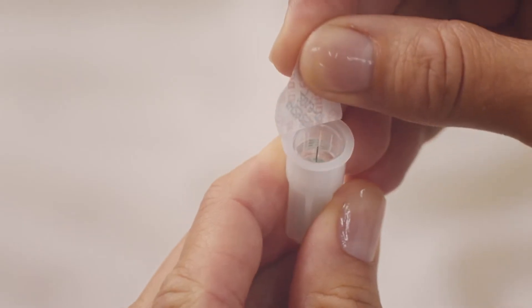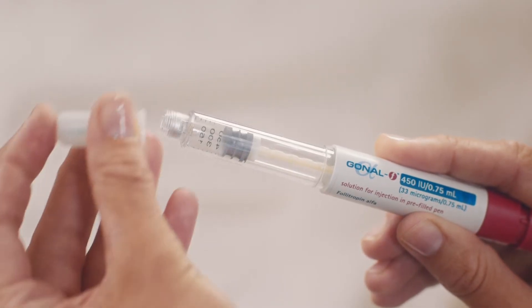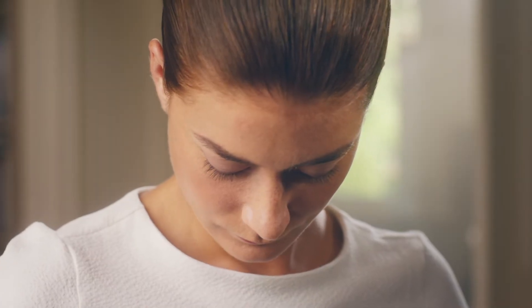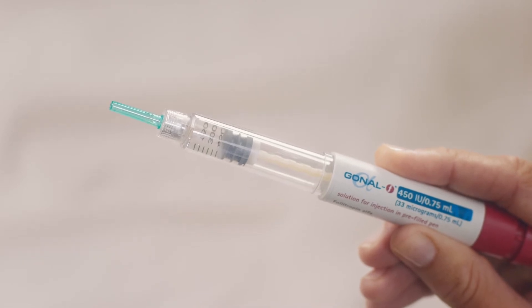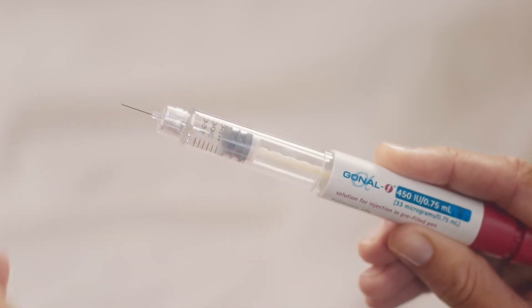If the seal is all OK, simply peel it off. Then put the threaded end of the pen into the outer needle cap. You'll need to screw it in until it's firmly locked in place — not too tight though, or it might be hard to take it off again. Then pull off the outer needle cap. Keep it handy though, as you'll need it later. And now remove the green inner needle shield.